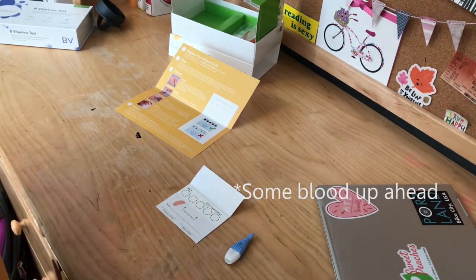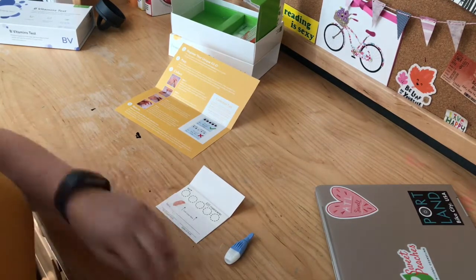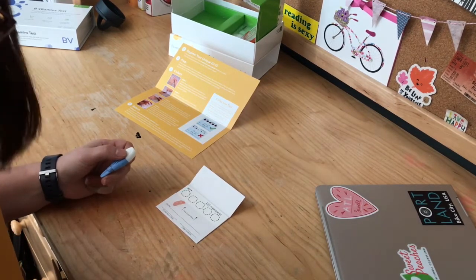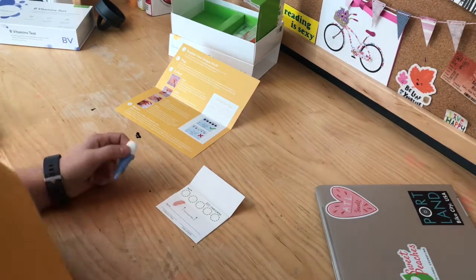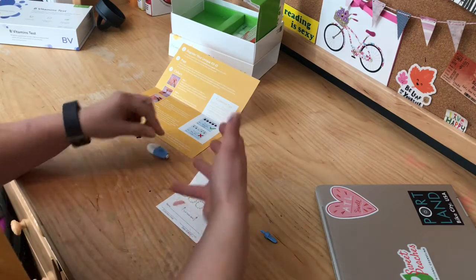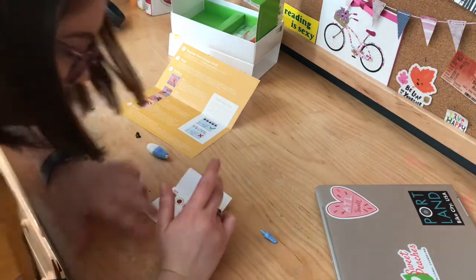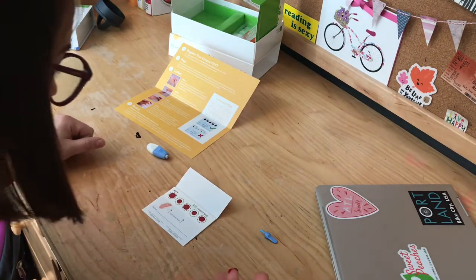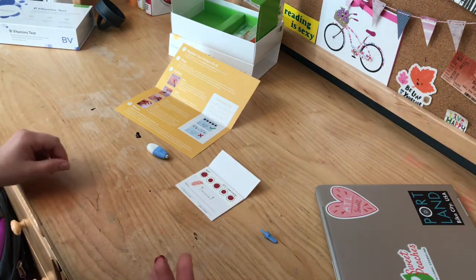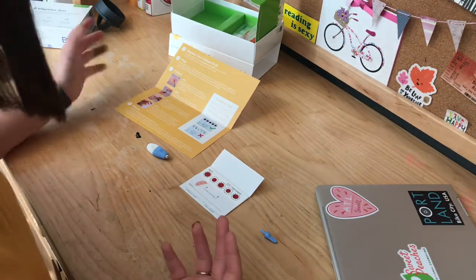Okay, this is take 2. I wasn't really bleeding the first time. I think maybe I pricked my finger a little bit in the wrong spot, so we're gonna try this again. Right now I'm shaking my hand down. I've warmed it up. I've drank a lot. Hopefully I'll bleed this time. Alright. Okay, this is looking much more promising. Alright, well, hopefully that'll do, and we'll get our results in a weekish.